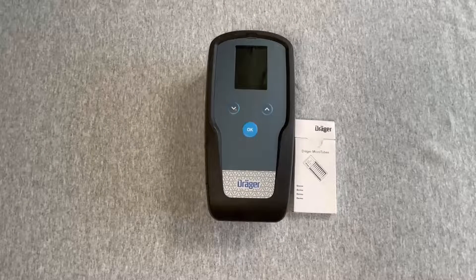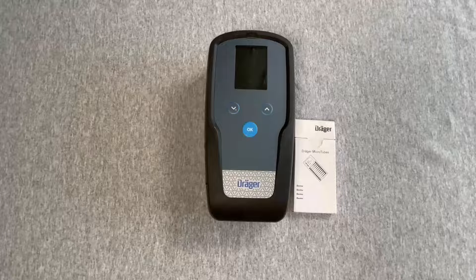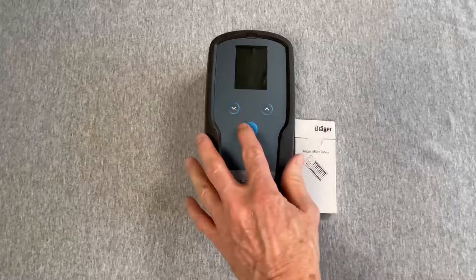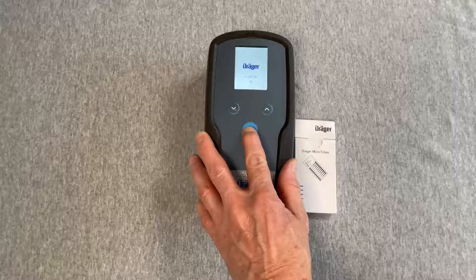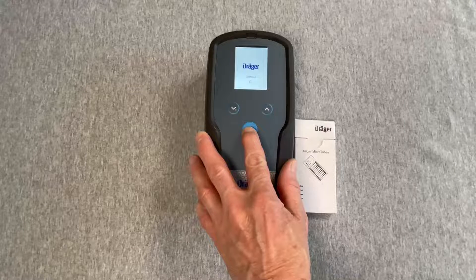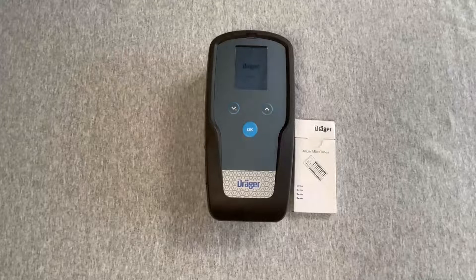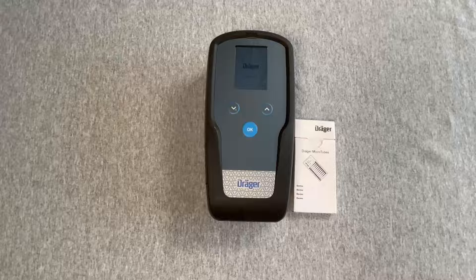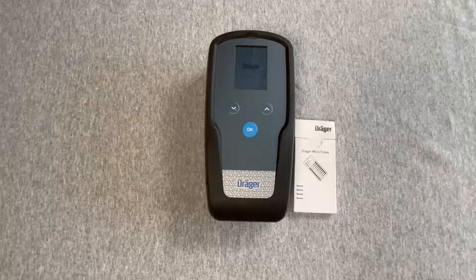The device has three soft keys to power on, power off, and access options including remote sampling. Press and hold the OK button for a 3-2-1 countdown. The self-test is initiated with the device conducting a diagnostics check. Next, 'Self-Test OK' is displayed, indicating the device is ready for use.